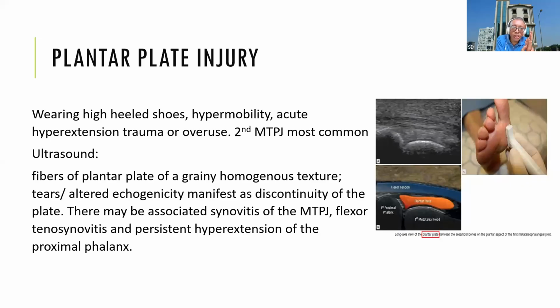Especially these plantar plates are more prominent in the hand metacarpophalangeal joint. Similarly, in the foot also, plantar plates are located in between the metatarsophalangeal joints. These are basically fibrous ligaments, from where the pulleys and sagittal bands emerge and stabilize the flexor and extensor tendons of the hand as well as in the foot.